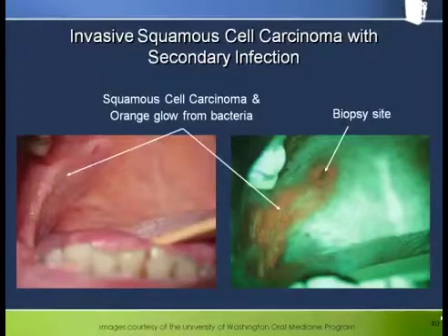An interesting note here is the tendency of bacteria and fungi to collect in areas of non-smooth mucosa in the mouth. In this case, the encrusted and textured surface of the lesion is a natural place for bacteria to become entrapped. This is the same thing that goes on in the normal mouth, where you tend to see porphyrin bacterial fluorescence coming from the filiform papilla, or fissures on the dorsal surface of the tongue and the palatine tonsil.